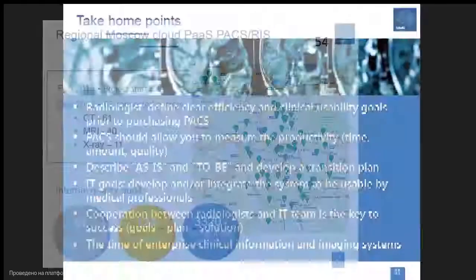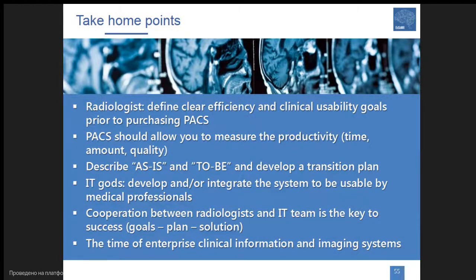So what are the take-home points? Radiologists should define clear efficiency and clinical usability goals prior to purchasing PACS. So it is impossible to change the PACS or to explain to the management that the PACS should be changed just because we don't like the way it presents the images. There should be clear management goals and usability goals that would improve the efficiency and foster the clinical effectiveness of the department. PACS should allow to measure the productivity, time, amount, quality.